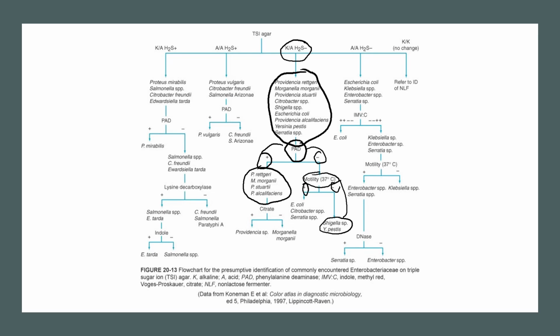If the motility test is positive, you already know that it's E. coli and Serratia, and how to differentiate those two species. There are certain strains of E. coli that may be non-lactose fermenters, but you don't see that as often as the lactose fermenters. But a small percentage of E. coli may be lactose negative, but glucose positive, of course.